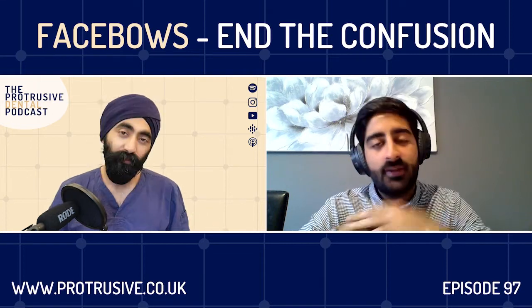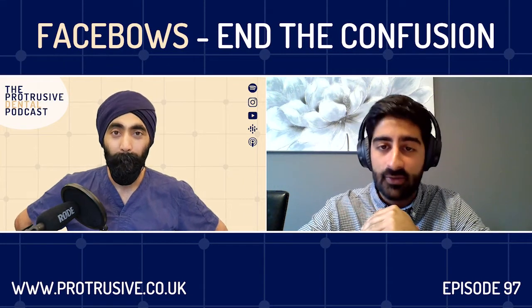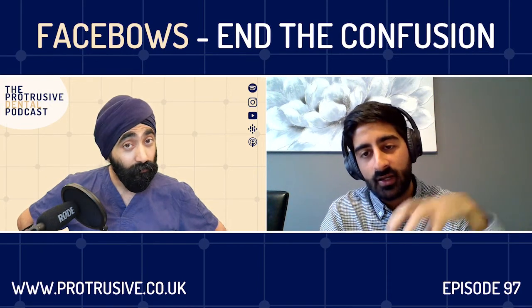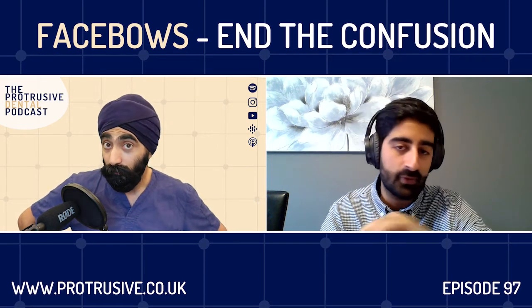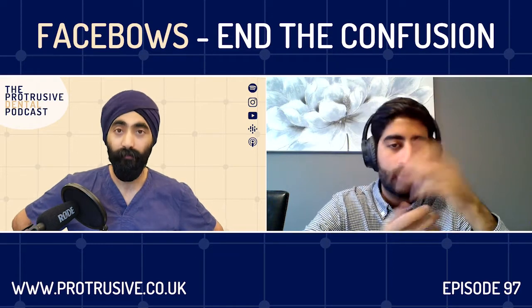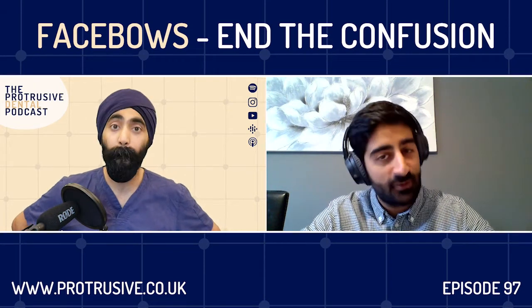So let's say we have just a regular patient, they've got upper and lower 7-7, which are sound, and I take upper and lower impressions and I tell the technician to mount it. Now when the technician puts those casts together and they mount them in ICP, that's a static relationship, and me sending a Facebow record to get that static relationship has no benefit whatsoever. Okay, but if I ask the technician to raise the OVD or increase the OVD by 1 or 2 millimeters and create a wax up in that position, I'd have to go back to basics here, just because I'm making sure that. So there's different types of articulators.